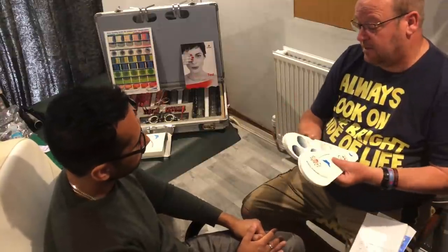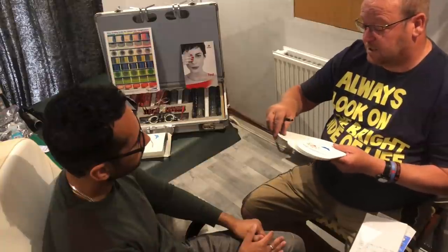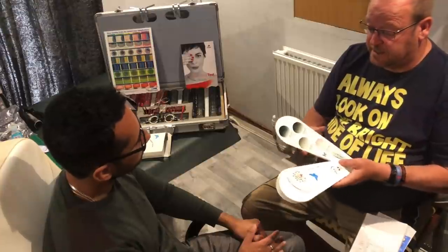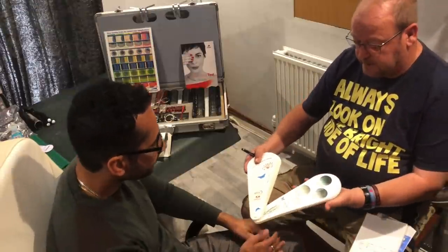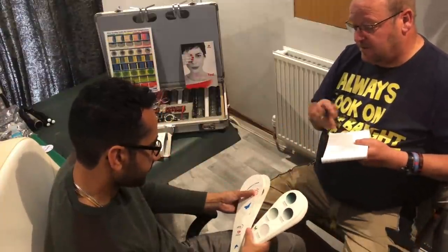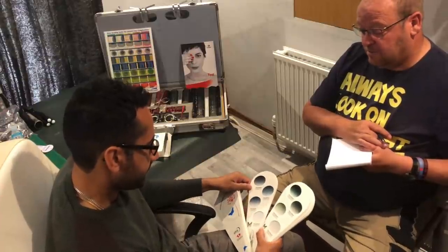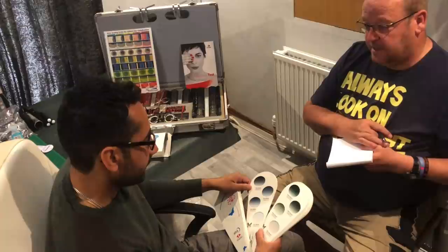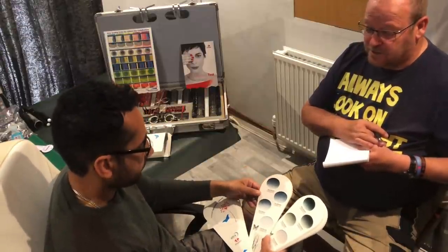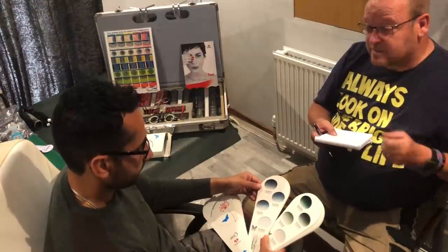We're probably only halfway through these tints now — we have got some much more specialised tints to come through. And now this is again showing you with the green tints. Although personally I think for your sunglasses, the solid green would be better than the graduated green. Whereas with the other colours, the graduated would have better benefits. But the green doesn't take away as much light.